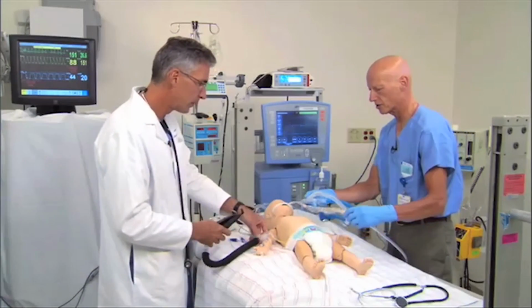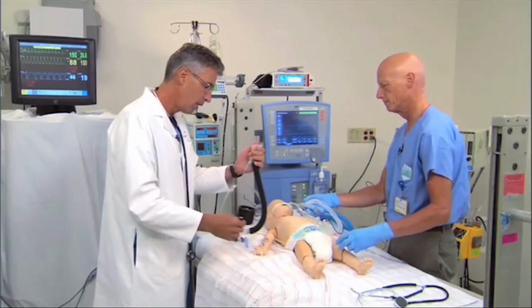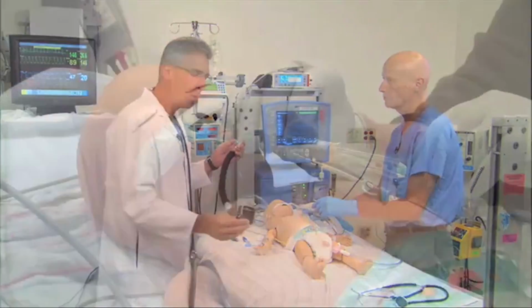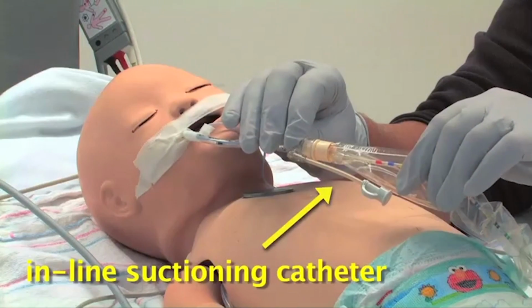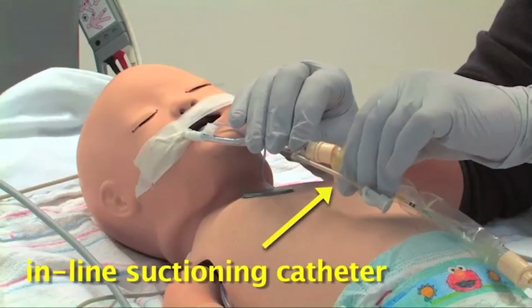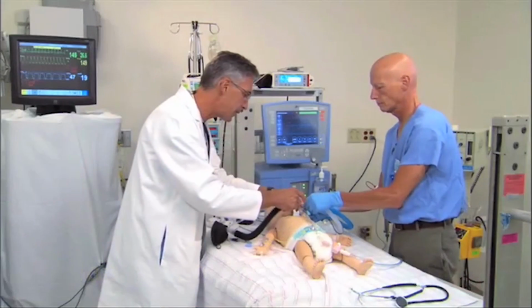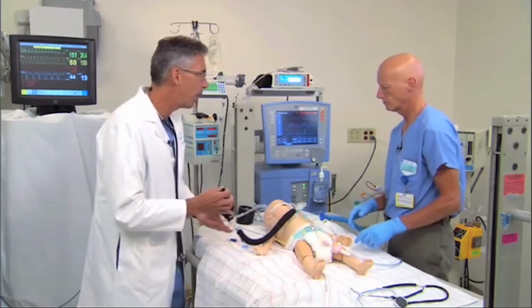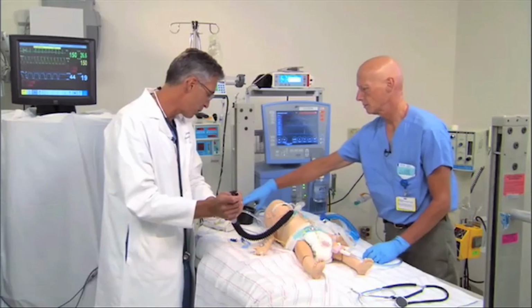We have an inline suction catheter, John, so anytime you're ready. That makes it easy. And I must mention that in our sickest patients, we typically will use inline suctioning devices to minimize separation from the ventilator. Okay, Barry, let's disconnect. I'll bag if you don't mind, Barry. I just want to get a feel for Samantha's mechanics.